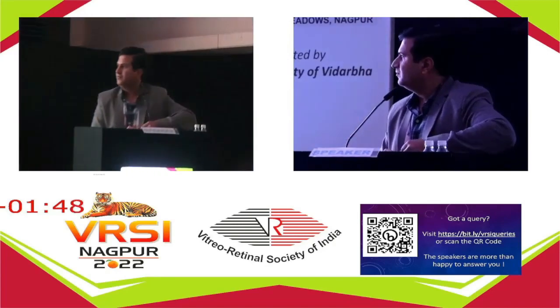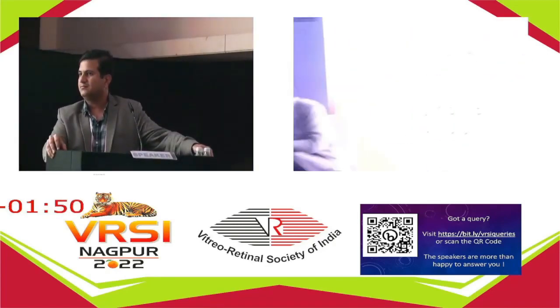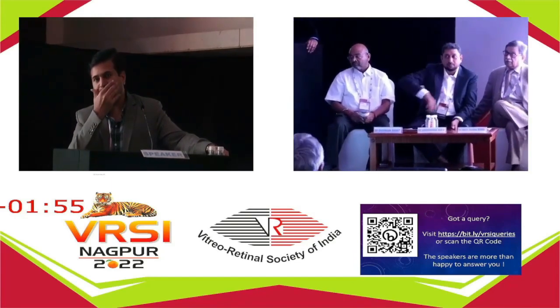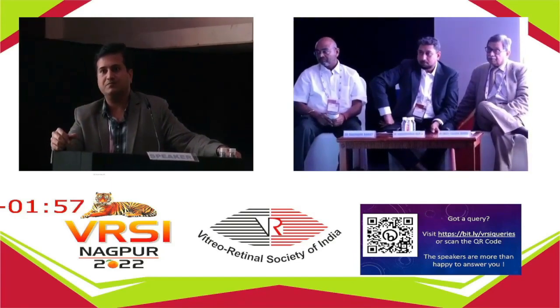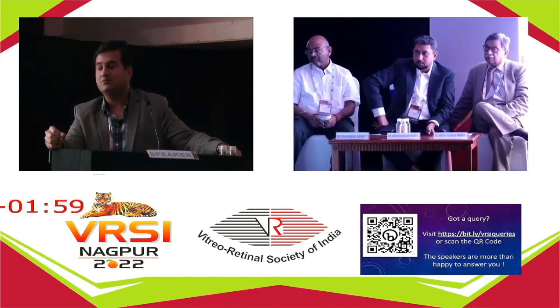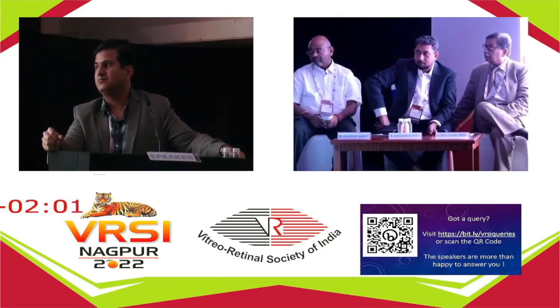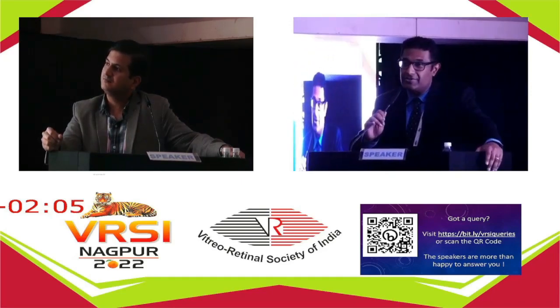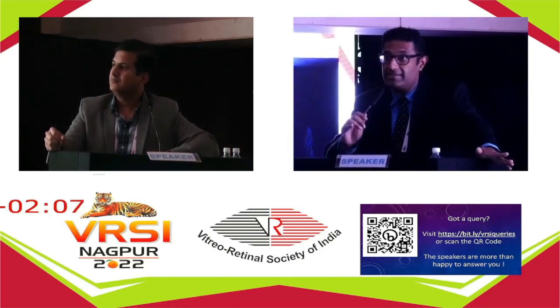You have a comment? Yeah, one question I have. How often, if you have a peripheral lesion, do you miss it on the wide field imaging but pick it up on indirect ophthalmoscopy? Yeah, again, I'm sorry I went so fast. The Eduardo Medina paper that was published earlier this year looked at that. So there are some cases that you would miss.